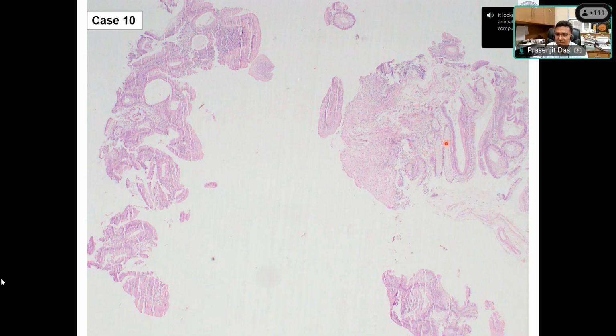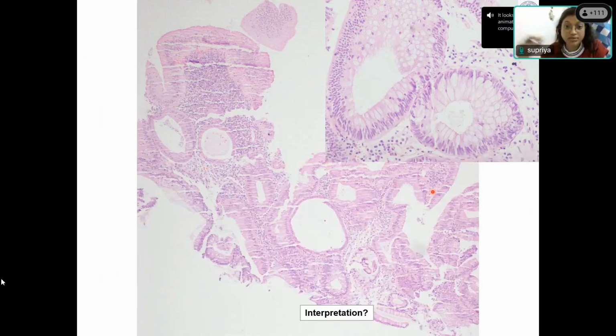Okay. Now you are talking about dysplasia. What are you talking about? Are you sure there is dysplasia? Another focus, I think one picture was given where I could appreciate this. Yes, sir. Dysplasia, low grade, high grade. So low grade, because of stratification, less number of mitotic figures here, and loss of polarity is also there, sir. Okay, I understood.